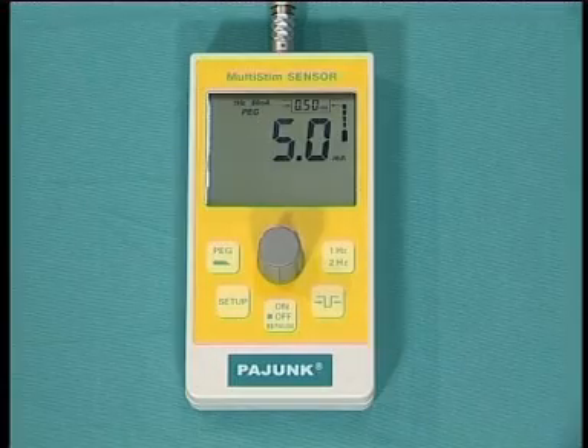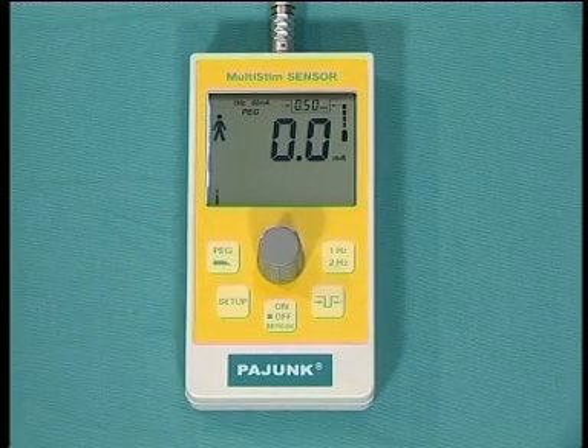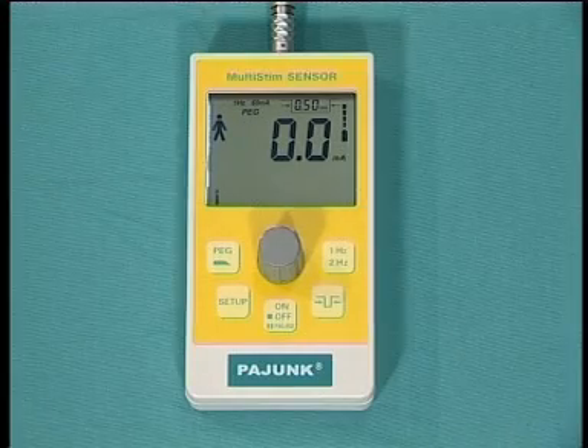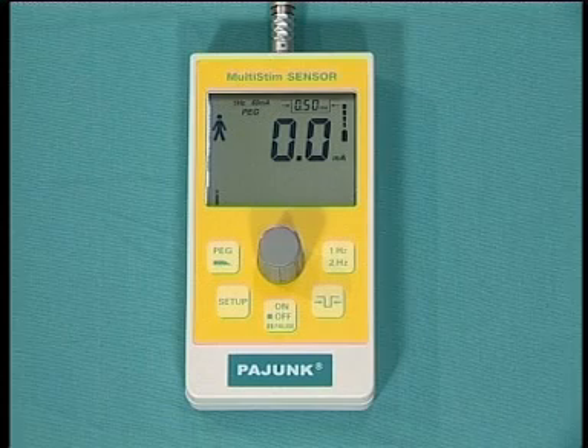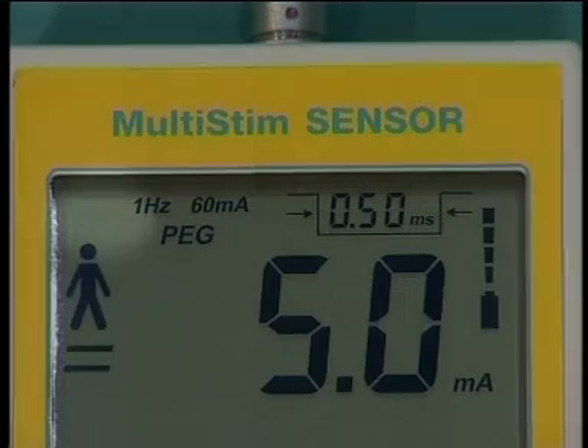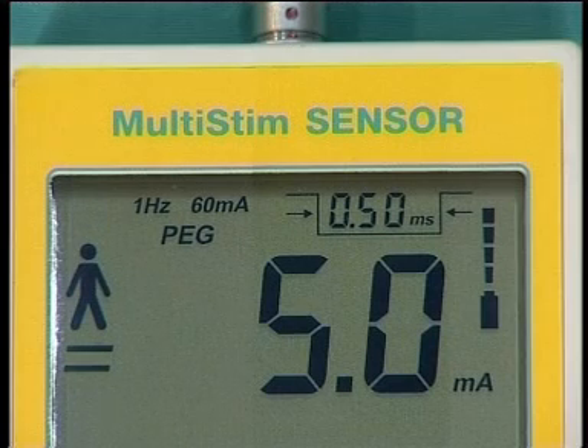To activate the sensor, press the grey knob. The main LCD display will stop flashing and a patient figure will appear together with a black flashing circle. At this time, the sensor will indicate the flow of current travelling through the patient. If the circuit is incomplete, then the reading will show zero. When the stimulation circuit is complete, the acoustic signal changes pitch, a further black circle appears, and the actual current travelling through the patient is indicated.